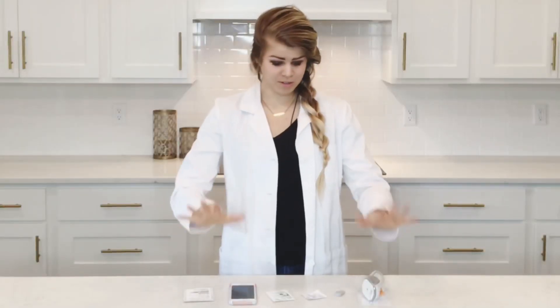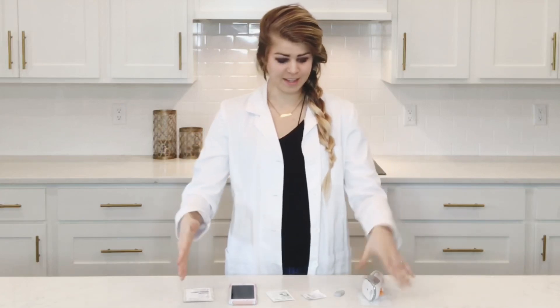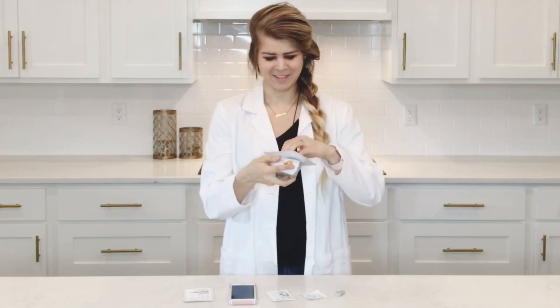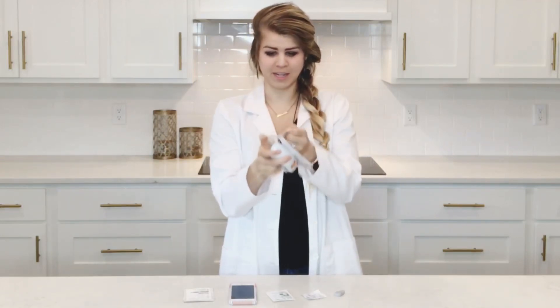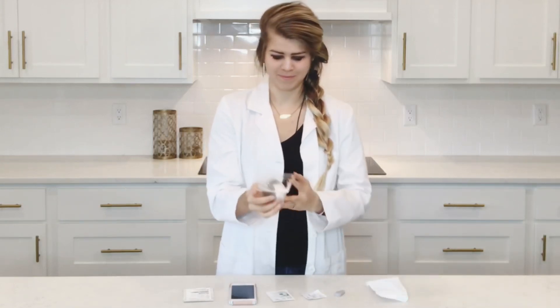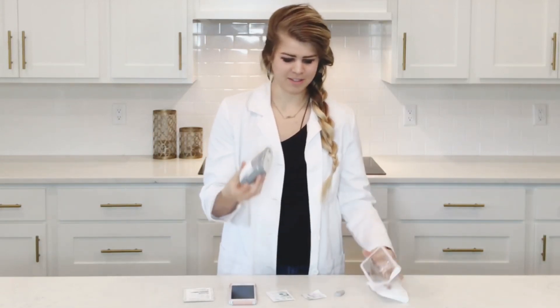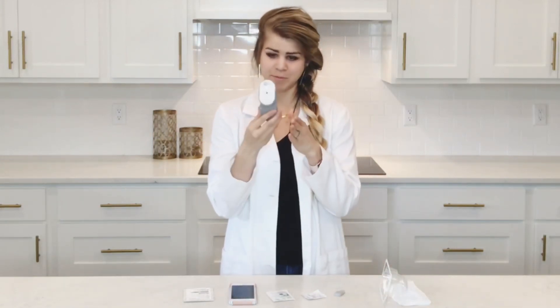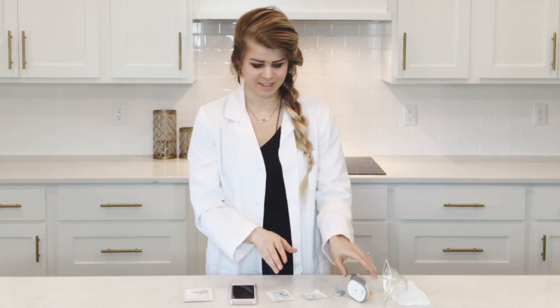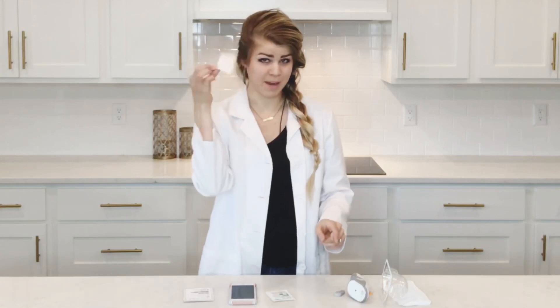So what we're first going to do is open our sensor. Find the right little tear label to open it up. We have our sensor out, it's nice and pretty, and I'm going to put that to the side because I want to prepare the area.